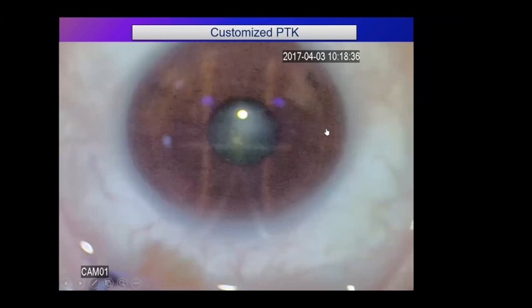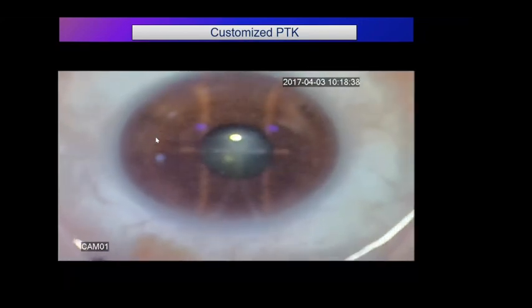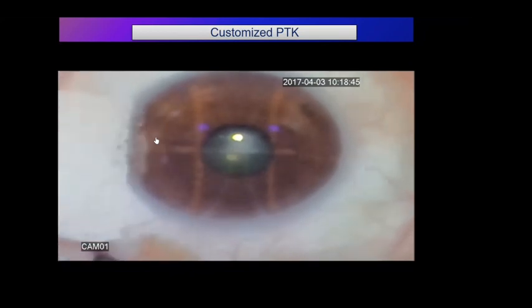Let us look at it. Now you will see I'm going to dry on the sides because I put the thick fluid. I want the thick fluid to be distributed all around the cornea. So I'm trying to dry it all around to make it as much as possible a homogeneous layer. And then when I apply, look at the irregularity. You see these rings? There are black and translucent ones. The black ones mean that we already reached the stroma. The blue ones are the troughs between the spikes. They're still there. So there are many sharp points.